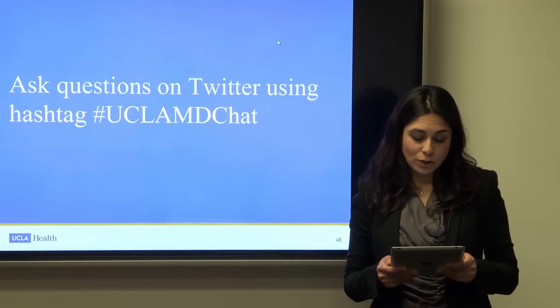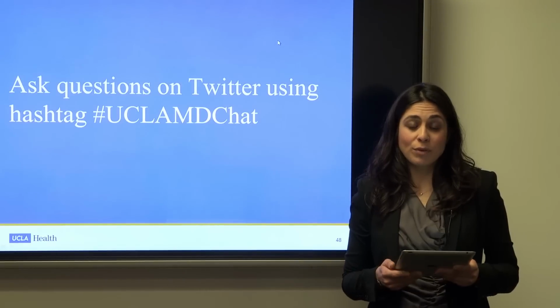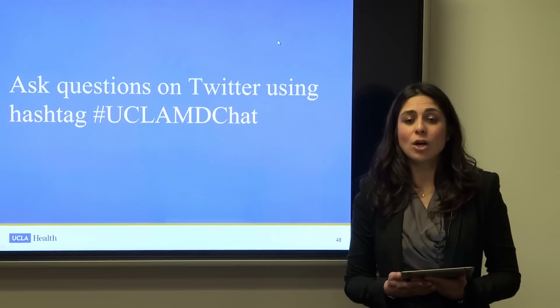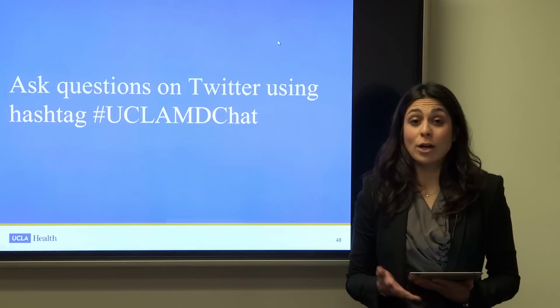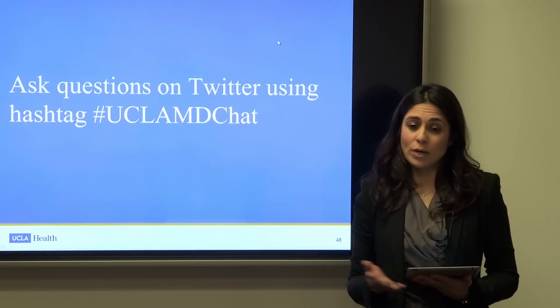How is a pediatric brain tumor treated? Pretty much the same way. If it's something where we feel like a patient needs protons, we would refer them for that, but that's usually in cases where we feel like normal parts of the brain will get dose that cannot be spared with photons. But we really just treat them in a similar fashion as what I just described.